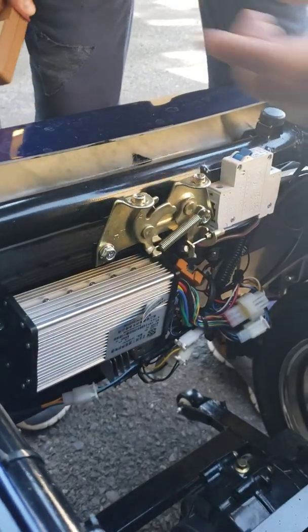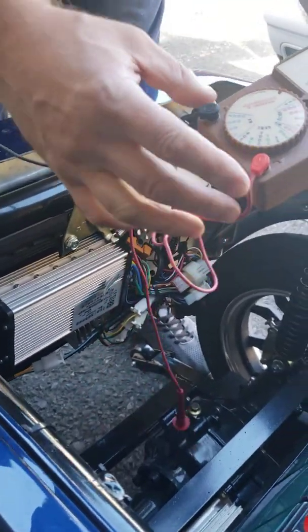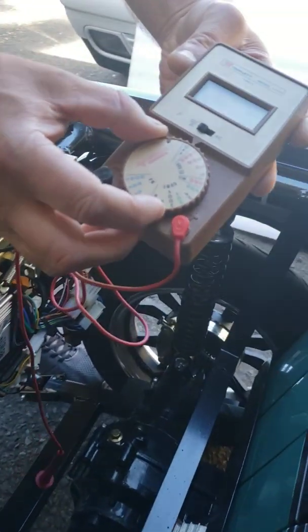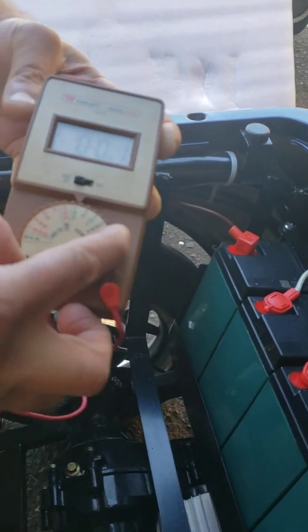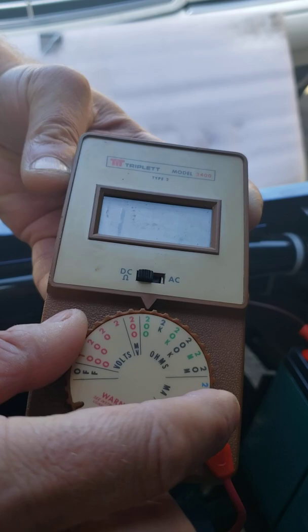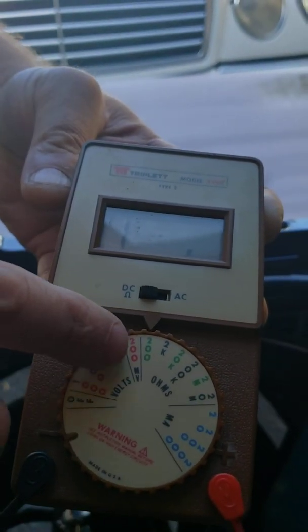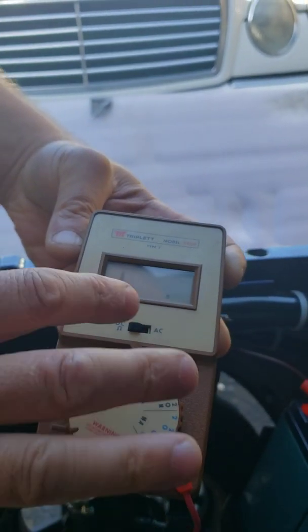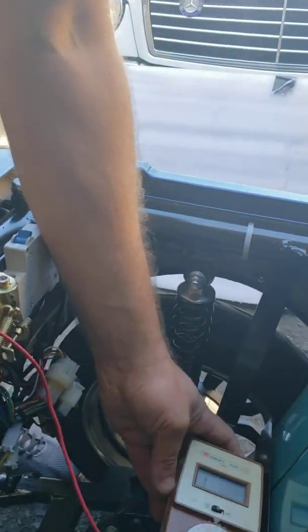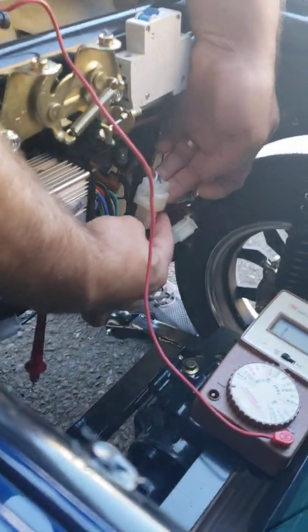Here is how to test it — you will need a multimeter. Set it to 200 ohms or 2,000 ohms; it doesn't matter. If you have a newer multimeter with auto range, it will set automatically. Just put it on ohms.